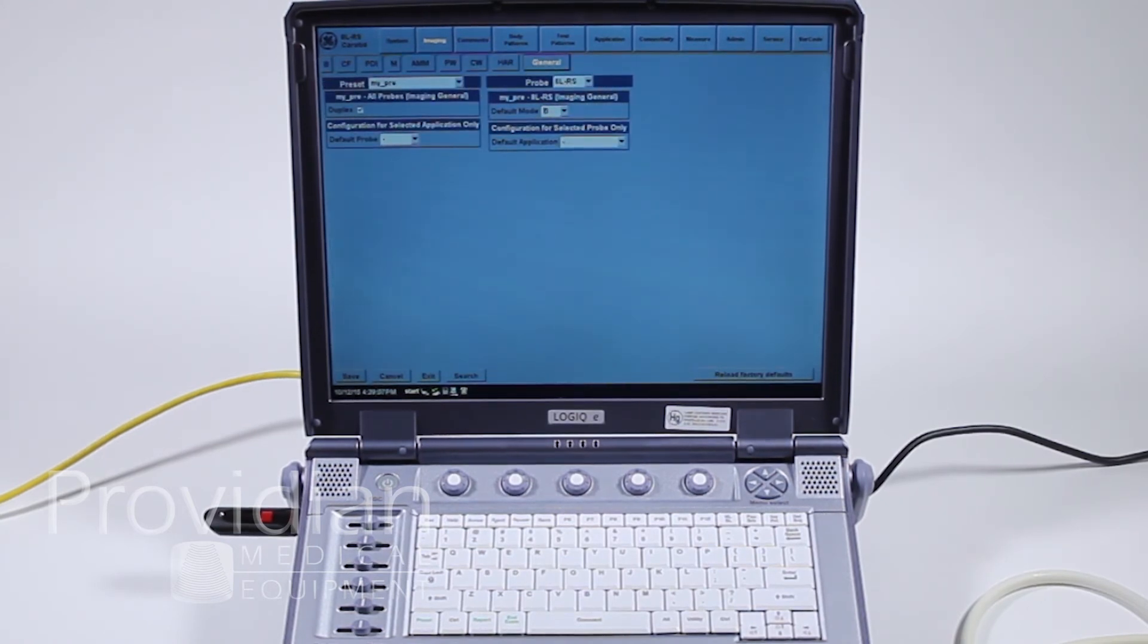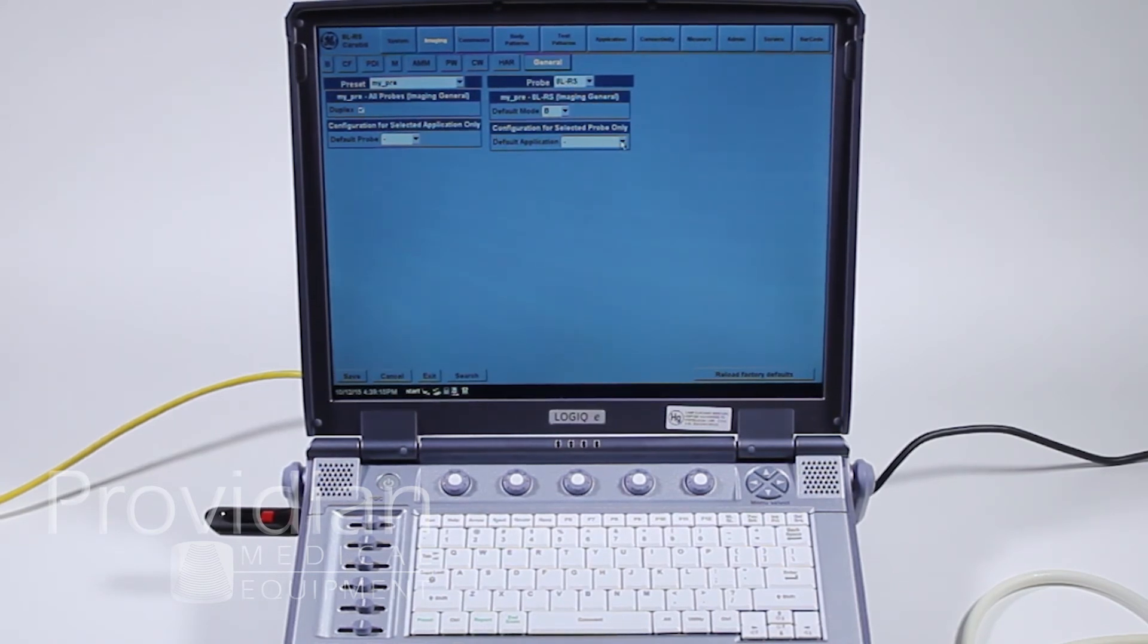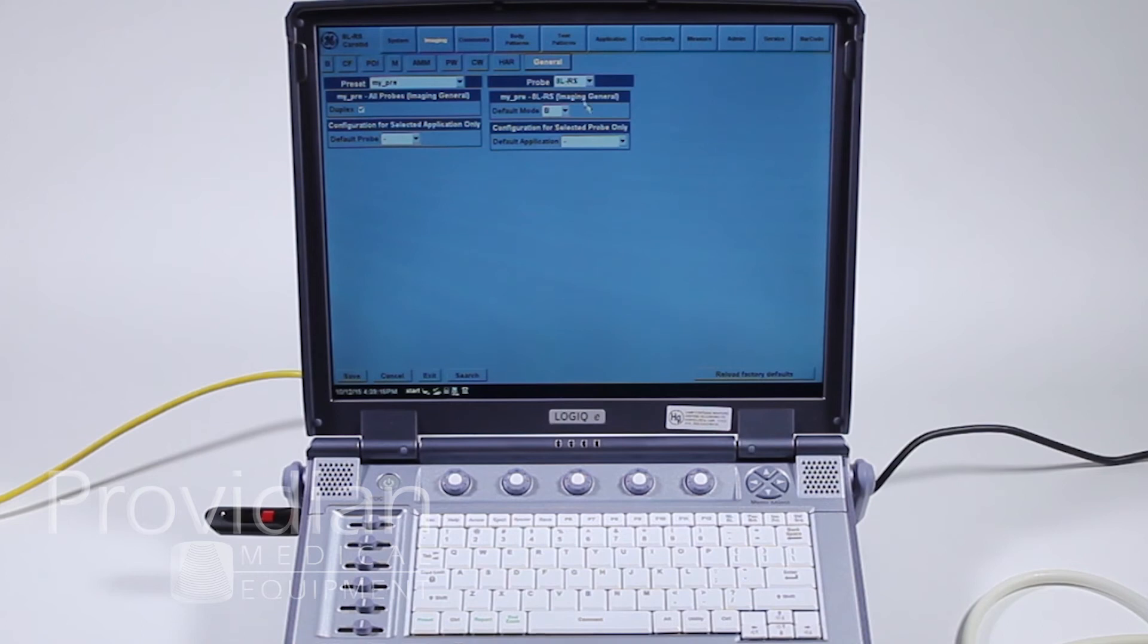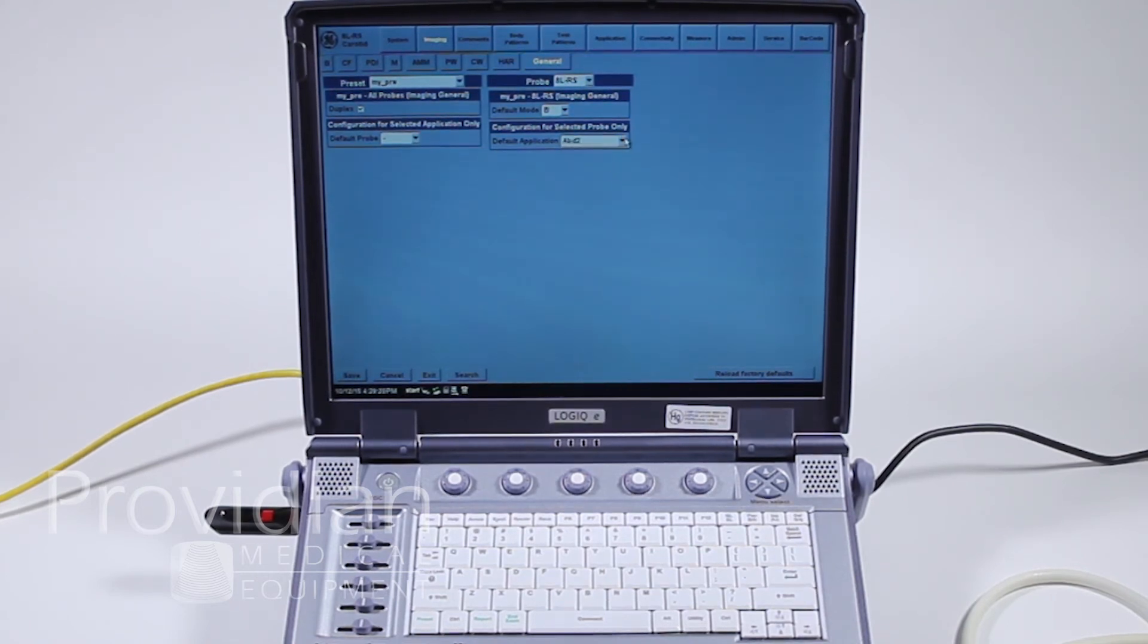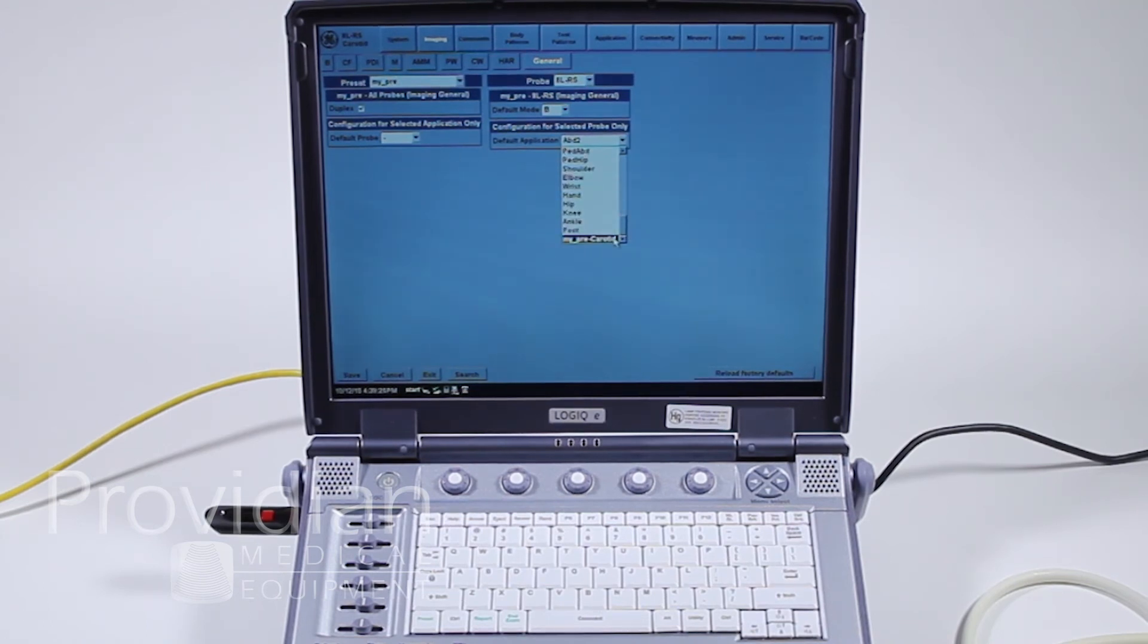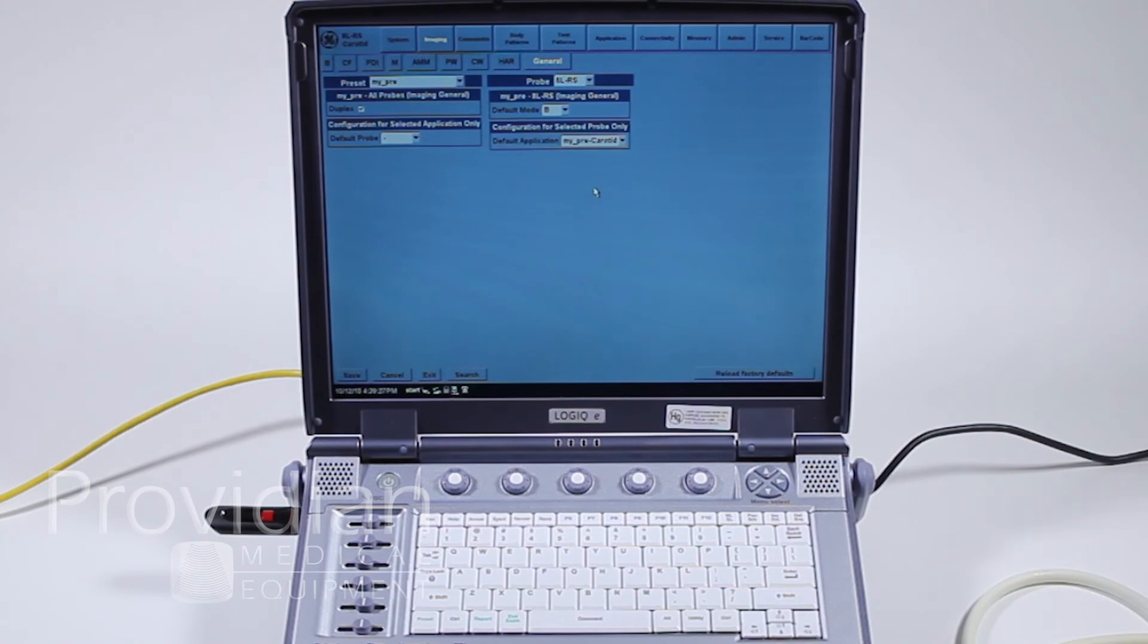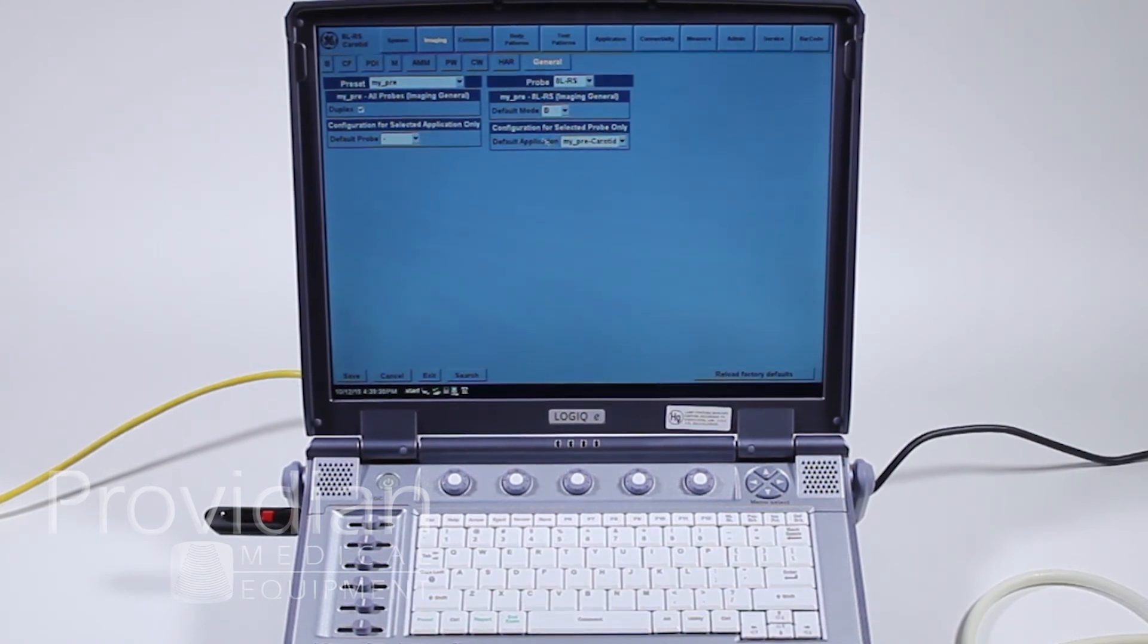Here we went to before where you saw the duplex and the default mode when you begin. So if I plug in this probe, I'm going to say the default application is always going to be abdominal 2. Or let's just say I want it to be the preset I just made. So my pre carotid right there. So that would be the default. Anytime I plugged in the probe, it would go directly to mine.